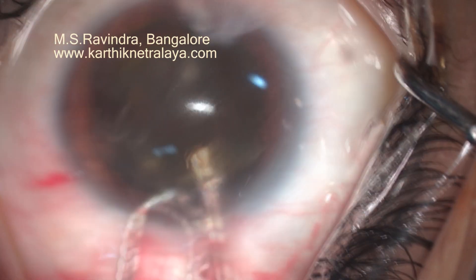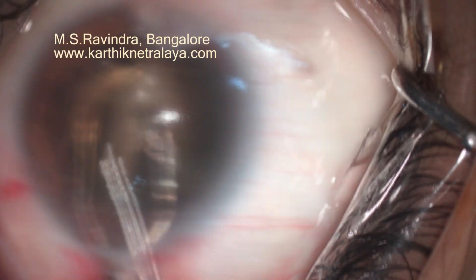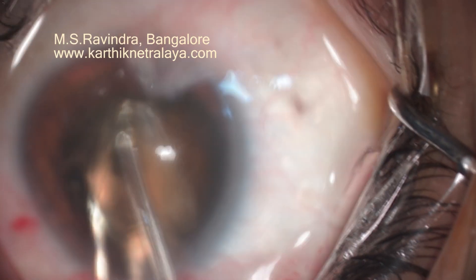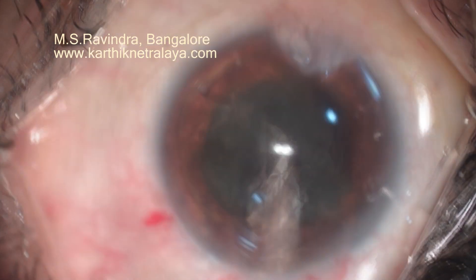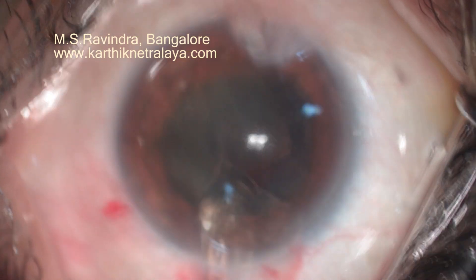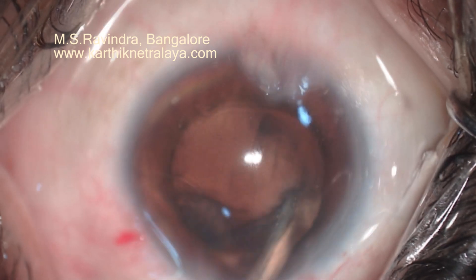This is an eye which has been vitrectomized and filled with silicon oil, posted for cataract surgery followed by silicon oil removal through a pars plana approach. Nuclear hemipieces were removed and cortex aspirated.